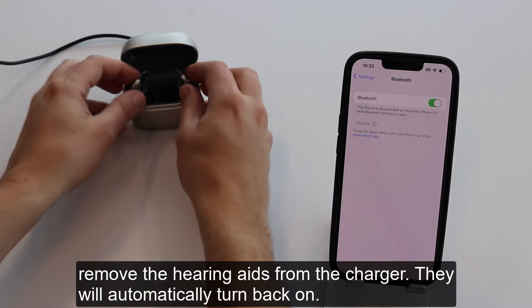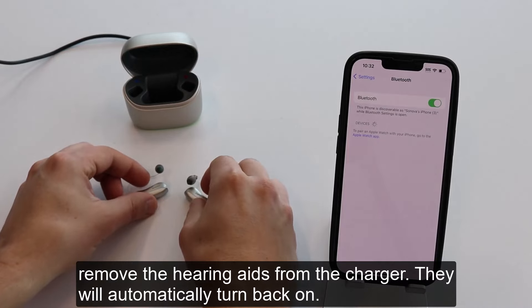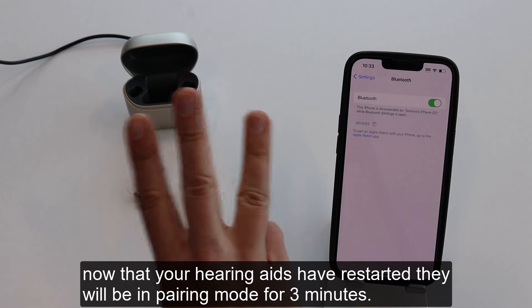Remove the hearing aids from the charger. They will automatically turn back on. Now that your hearing aids have restarted, they will be in pairing mode for 3 minutes.